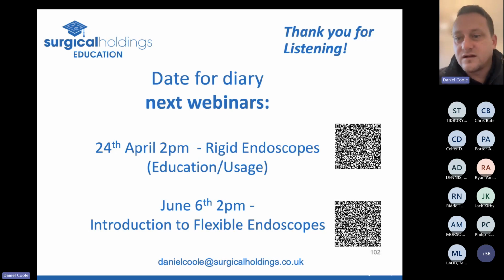Key dots, I know they're widely used. Just from a manufacturing perspective, it's not something I would personally use. Just because, is there a slight chance that the key dot could come off? Perhaps. Obviously, other options are laser marking. Laser marking can also have its challenges: if you don't passivate or treat the mark after you passivate, then potentially you can get rust. So there are pros and cons, but sticking things on instruments is, in my opinion, not something that I would probably do. I would opt for laser marking.